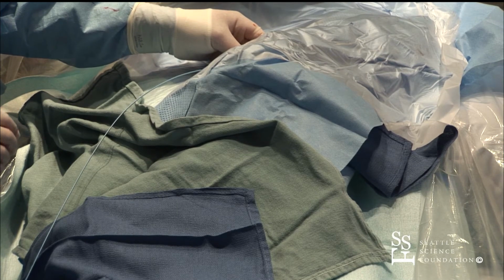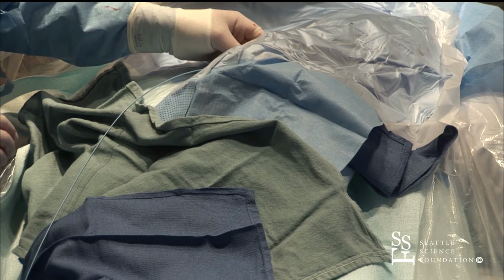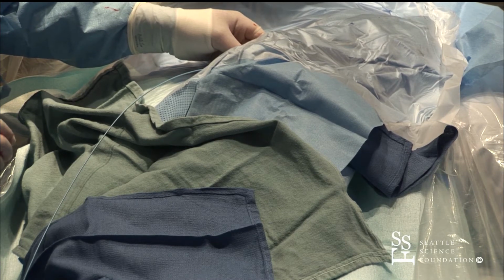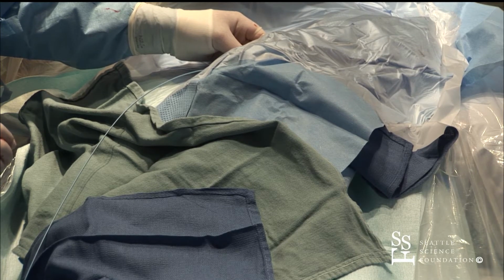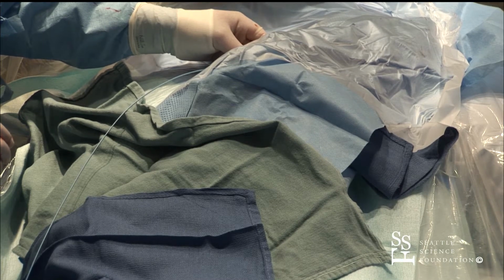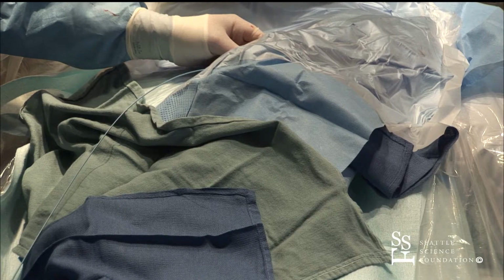And Laura, who's here with me, is helping with this, and it's going smoothly. So John's comfortable with Laura doing that because he knows Laura. I'm not. I want to move the wire myself. I mean, not Laura, but I like to move the wire myself because that feel thing is really important to me. Okay.